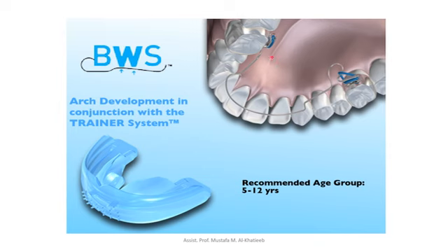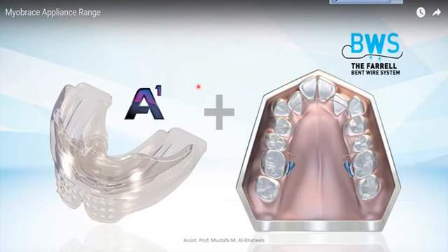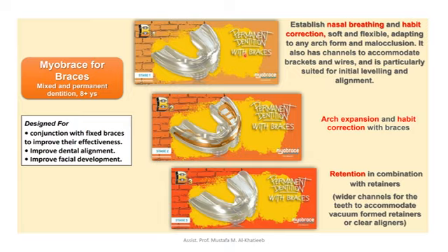Here are the bands with the sheath and the expansion arch inserted into this sheath. Arch development in conjunction with the trainer system. We use the trainer system with the arch expander at the same time, and the recommended age is between 5 to 12 years. Usually we use A1 with the Farrell bent wire system for arch expansion and alignment.